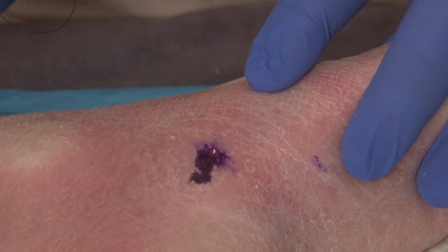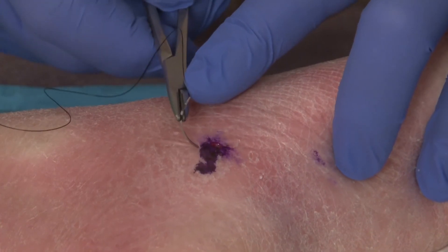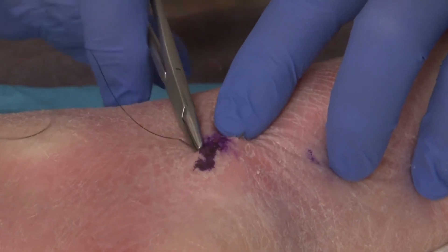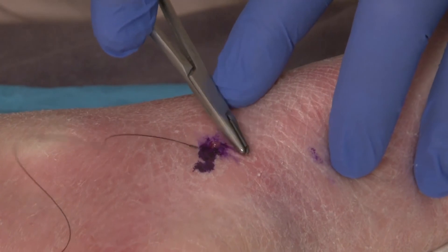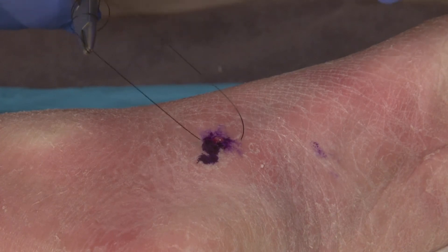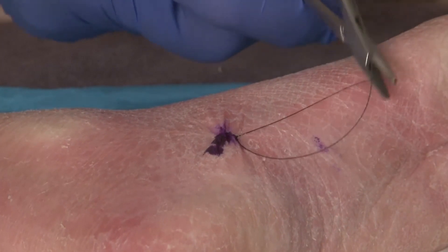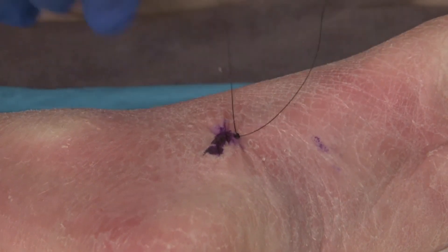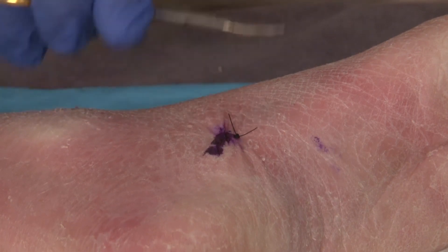When we have a 3.5 millimeter or larger punch biopsy, I frequently recommend putting a suture in to hold that still. For smaller punch biopsies 3.0 and below, I almost never put a suture in. This is just to close the lesion during the early stages of recovery. Then put a small band-aid over this for post-op and remove the suture in seven days.